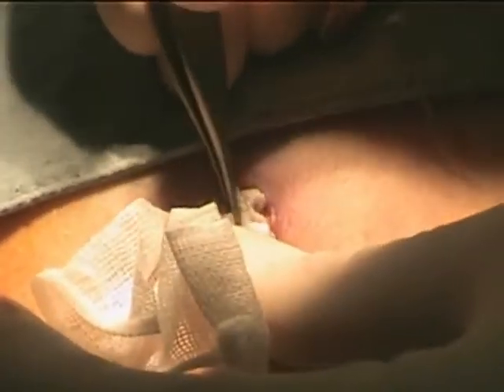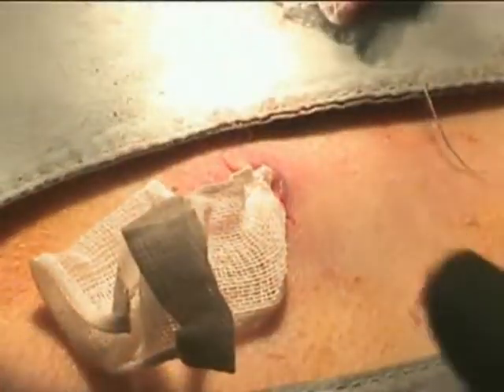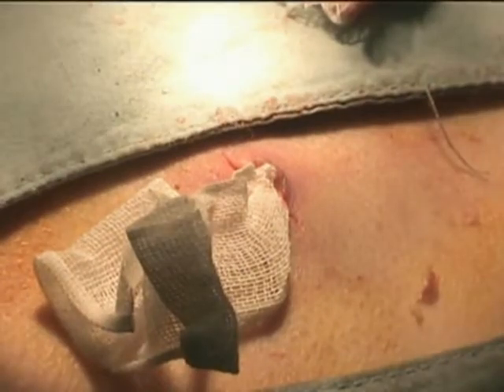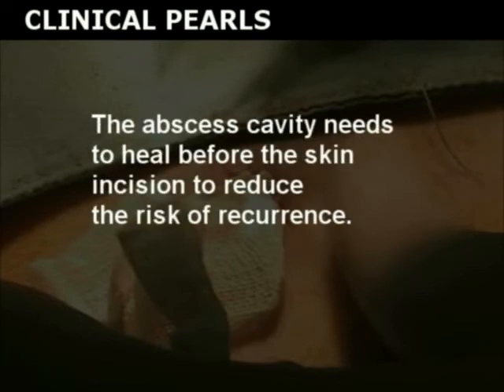Apply an ointment over the wound to prevent packing gauze from sticking to the overlying dressing, which can lead to accidental removal of the packing when the dressing is changed. Healing of an abscess should progress from the inside out. The abscess cavity needs to heal before the skin incision to reduce the risk of recurrence.